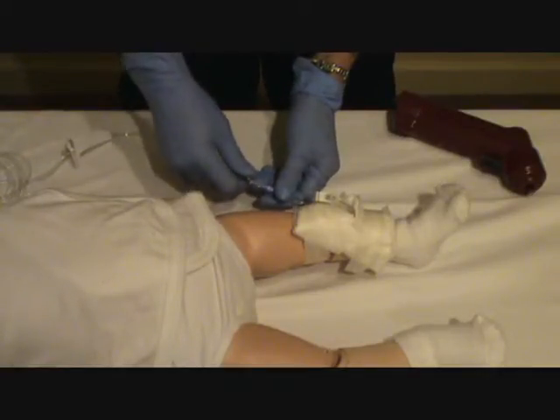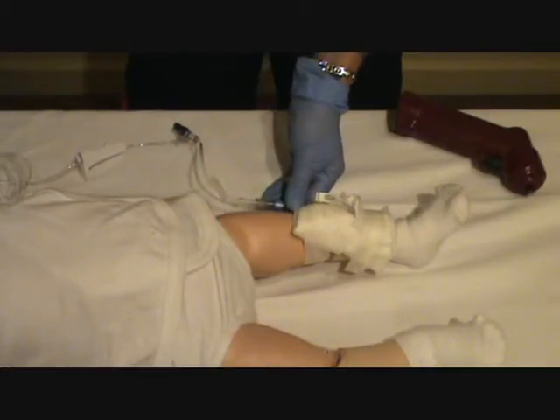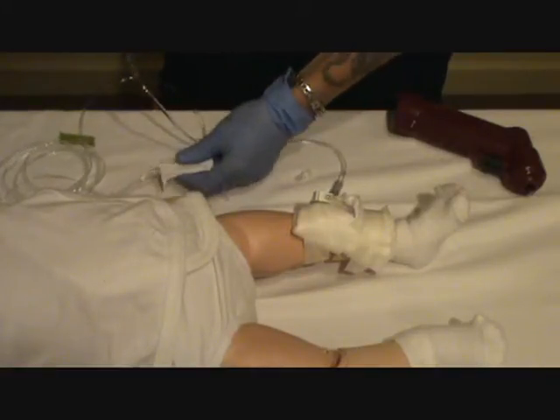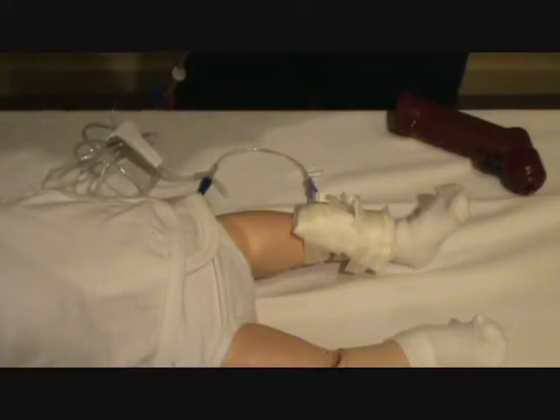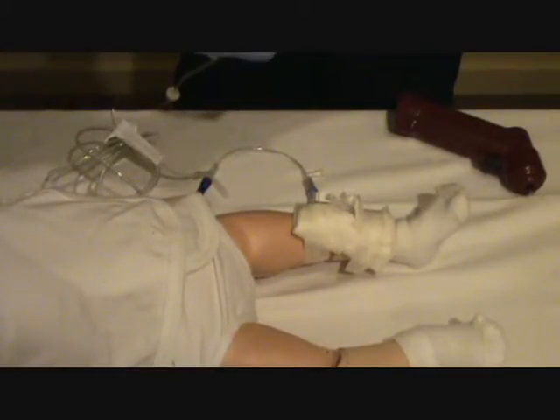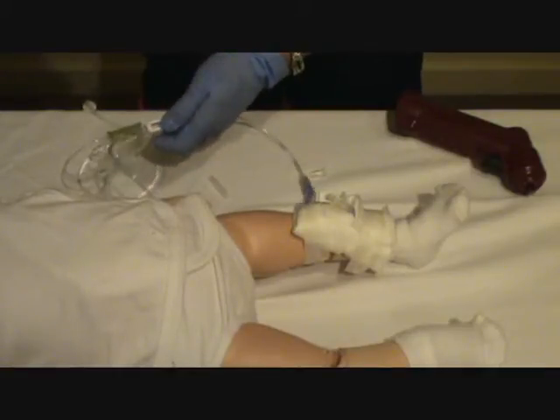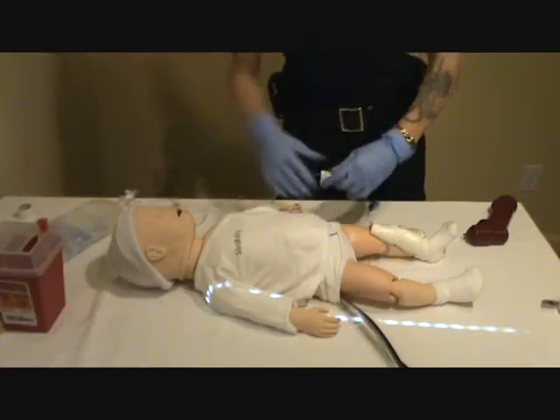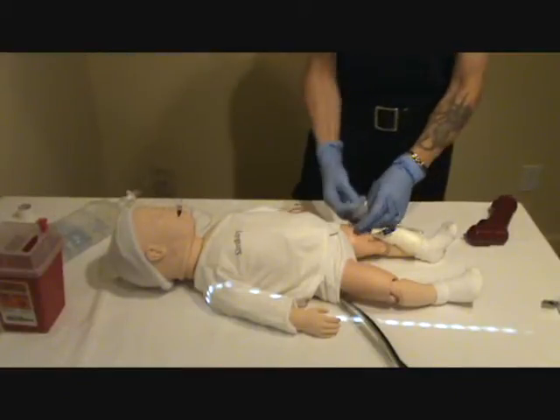And at this point, we want to attach our infusion set, and as we attach our infusion set, we want to initiate flow using pressure. So the IV bag of fluid should get a good squeeze to ensure proper fluid flow into the patient. Once we've administered the fluid, we want to make sure that our extension line is secure and we can administer as we would any other medication or fluid for our patient's needs.